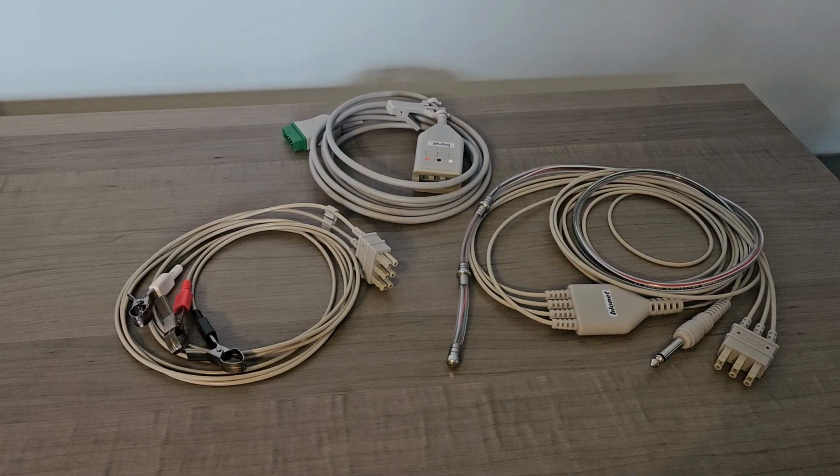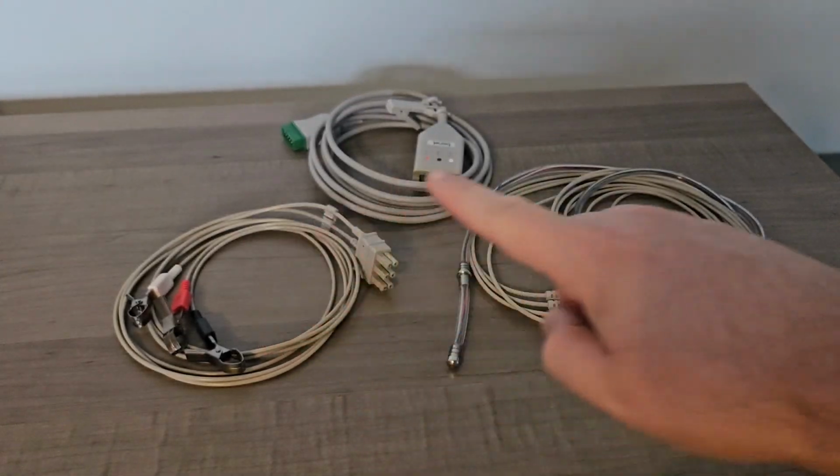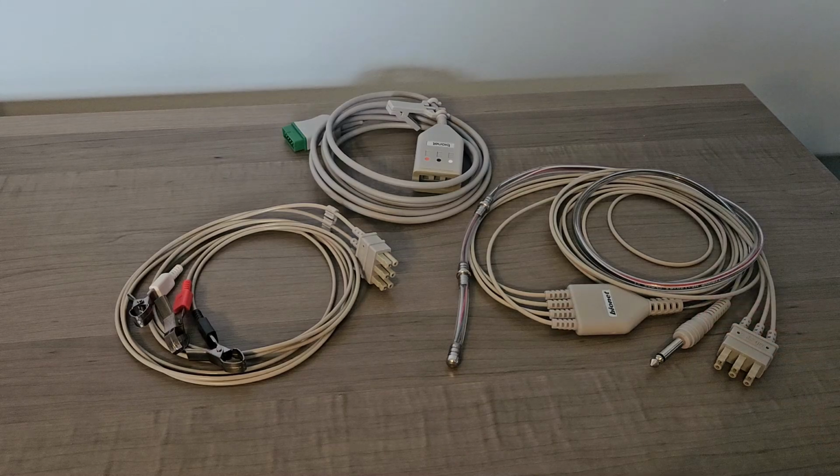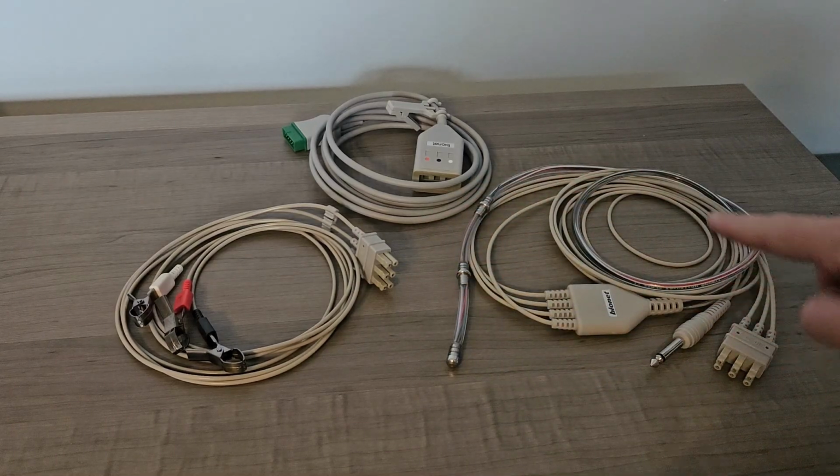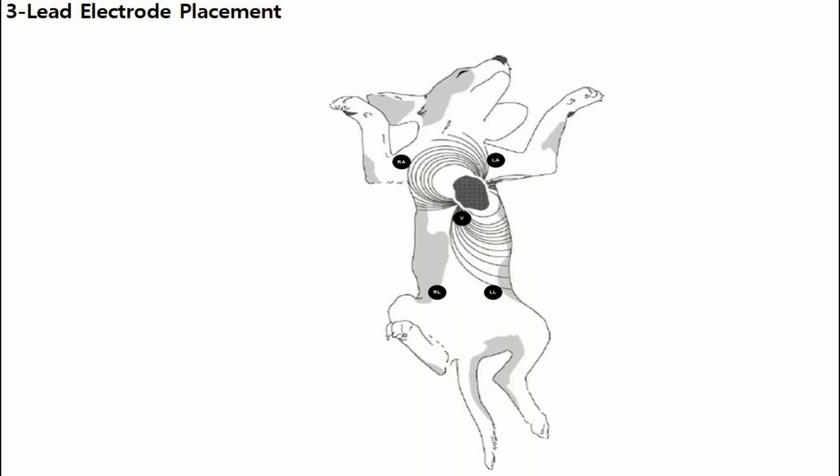Your monitor comes with both 3-lead ECG clips and an esophageal probe for ECG and temperature in one. Both of these can be plugged into the ECG extension cable. Position the ECG clips using the following diagram as a reference.